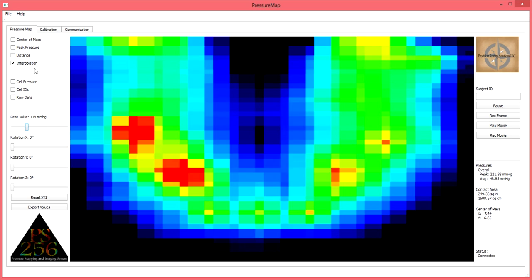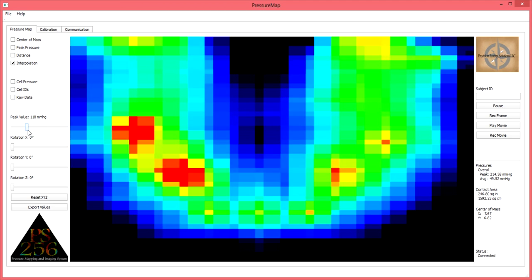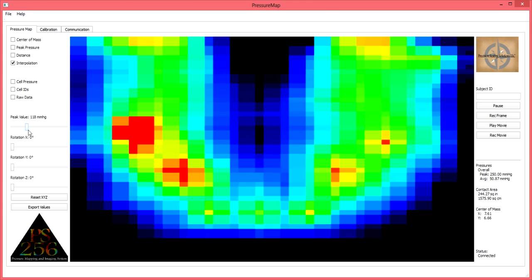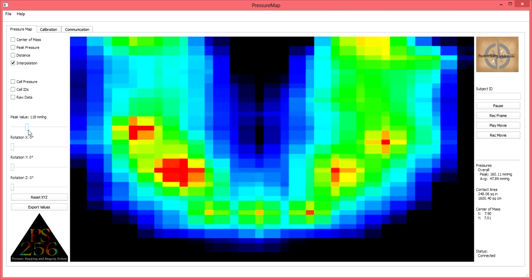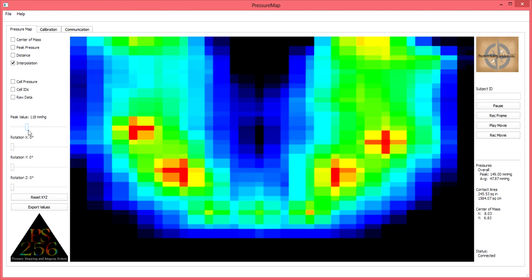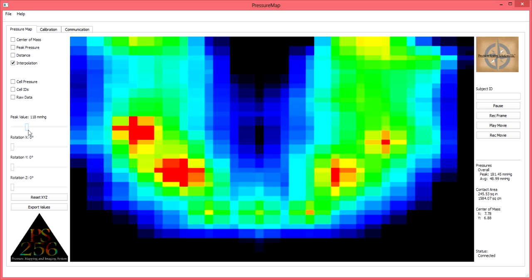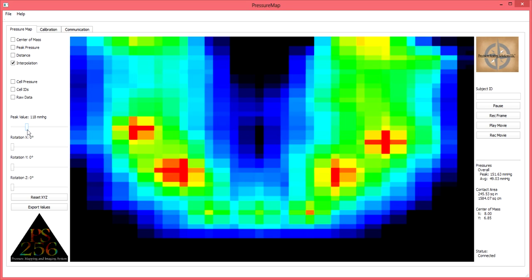The peak value scale, located on the left of the software screen, is a fully adjustable value scale which will adjust the color scheme of your display accordingly. As this peak value scale is adjusted, you will notice changes to your color scheme.